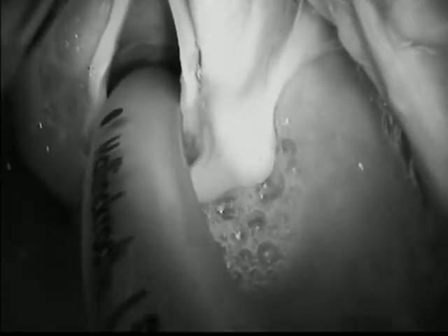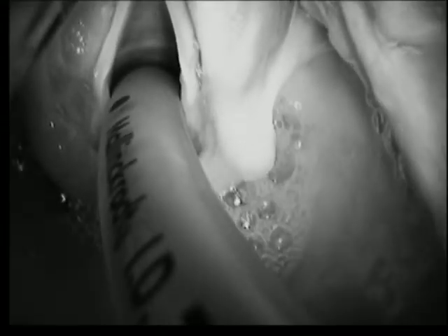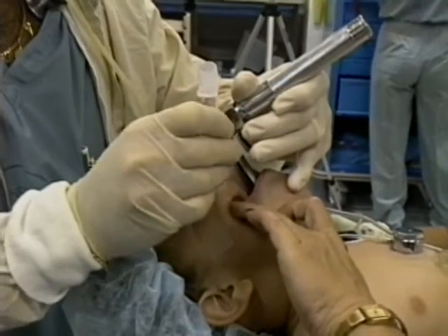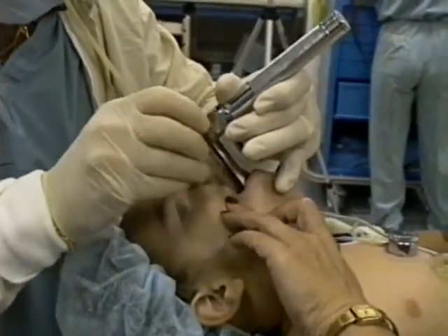In an adult or child older than about 8, the opening through the vocal cords is smaller than the cricoid. The vocal cord gap is triangular in shape and a round tube won't seal it. Therefore, a cuff below the cords is now needed to provide the seal. Other differences in pediatric airway anatomy and intubation technique are too numerous to discuss here.